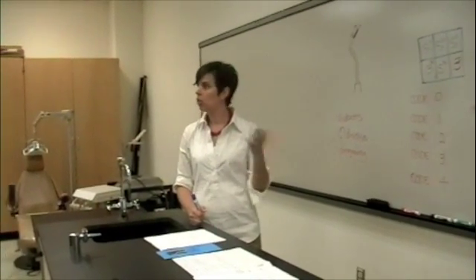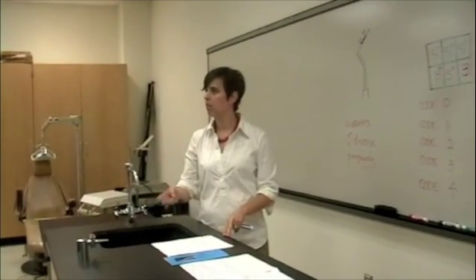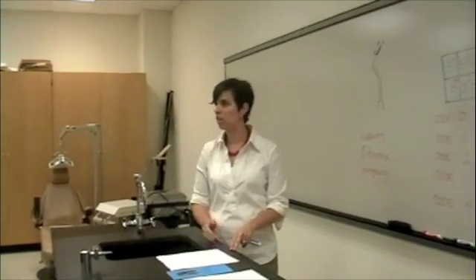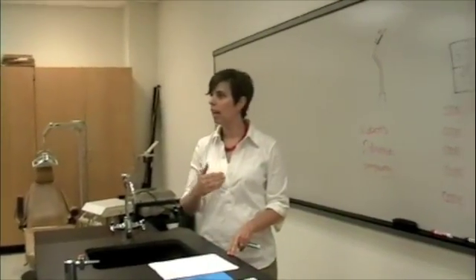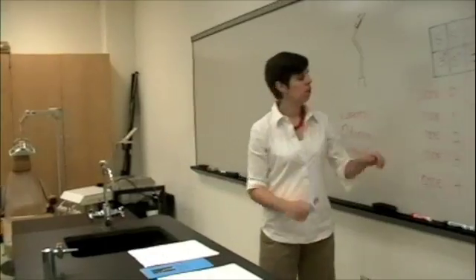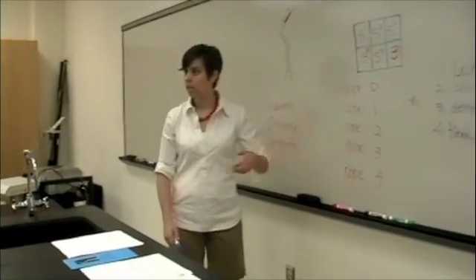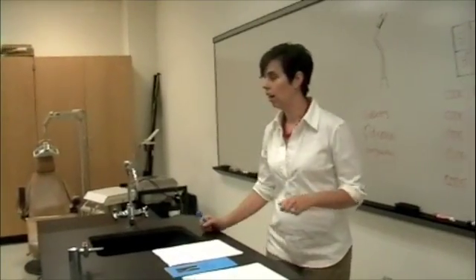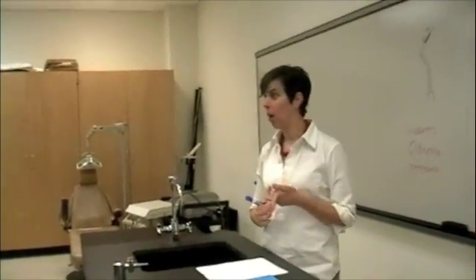You can do the PSR the other times. So maybe they're on a 3-month recall; the other 3 times of the year, you can do this PSR. This is a great way to still keep up with what they're doing. And if you find a code 4 and it wasn't a code 4 before, then you can say, hey, look, we see what's going on here. So it's a good way to shorten the time, and still maintain a great standard of care. So, any questions?